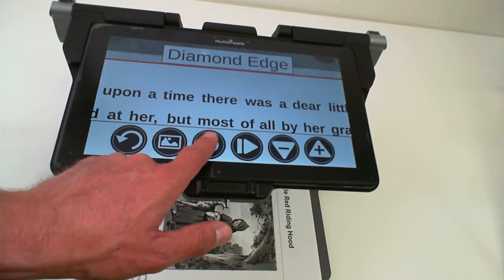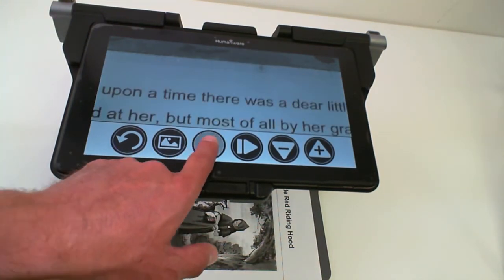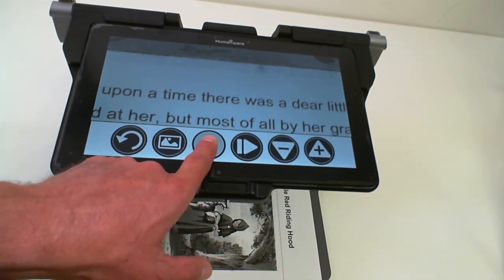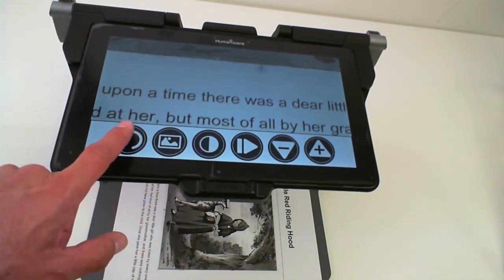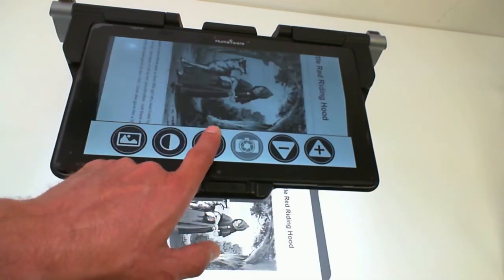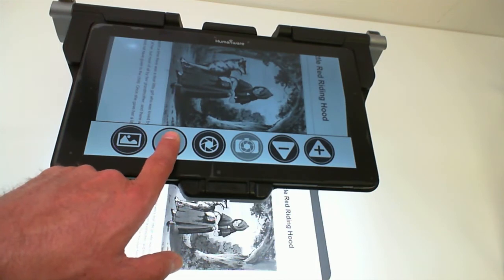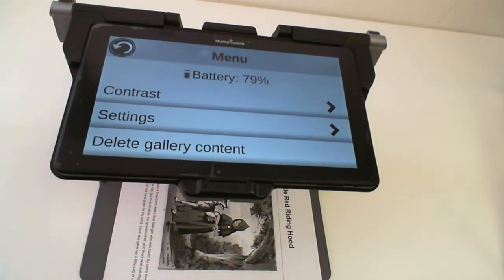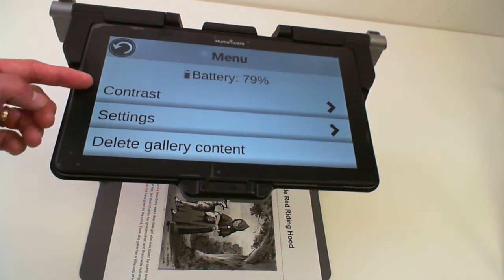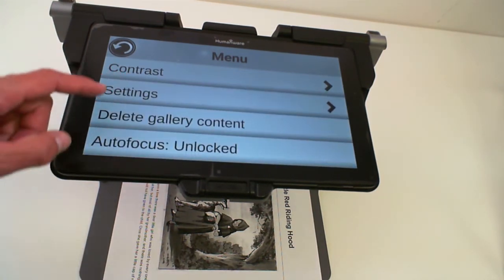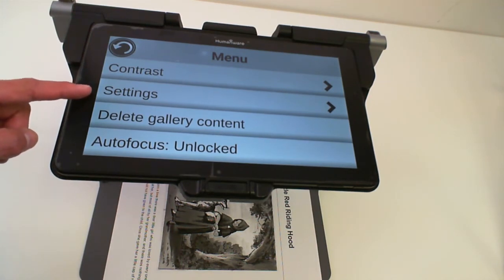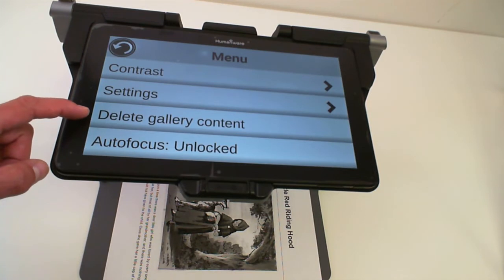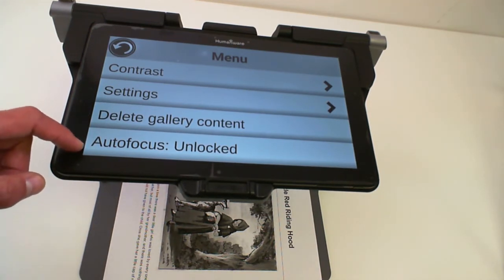In order to add more contrast colors to my contrast button, I press and hold the contrast button for about five seconds. I need to be in my Magnification application. Once I have pressed and held the contrast button for five seconds, you are brought to a configuration menu which has a couple of settings: contrast settings, an option to go to the full settings of Prodigy, an option to delete the gallery content, or an option to lock your auto-focus.